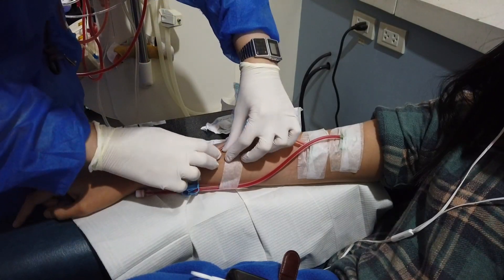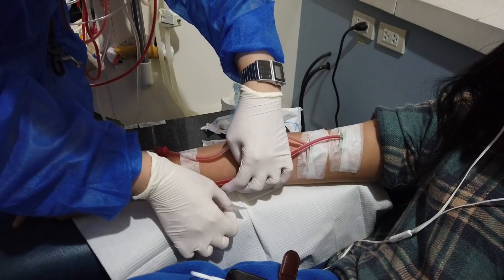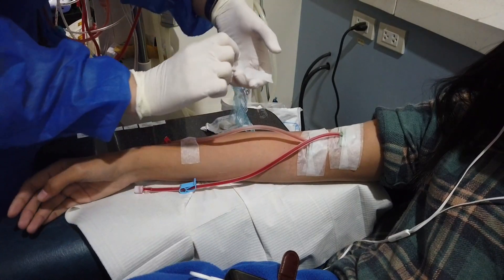Remove the plaster following the direction of skin hair growth, and support the skin with your fingers of the other hand while slowly lifting the tape. This allows the plaster to lift painlessly and maintain skin integrity.